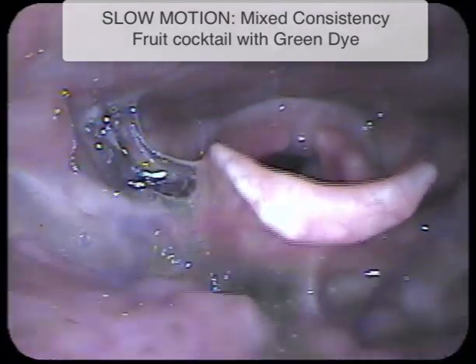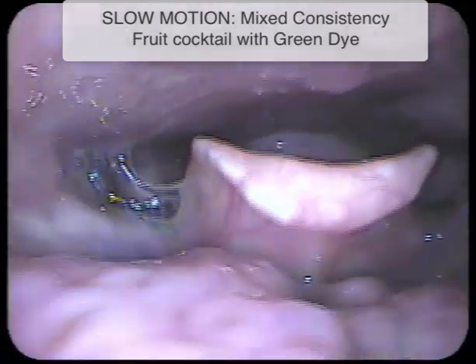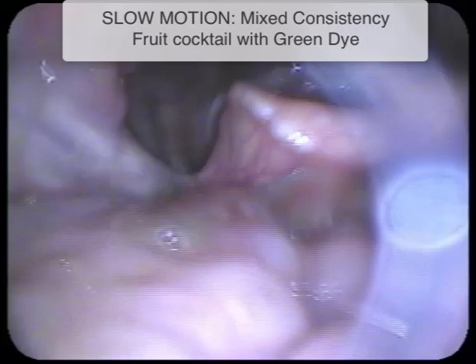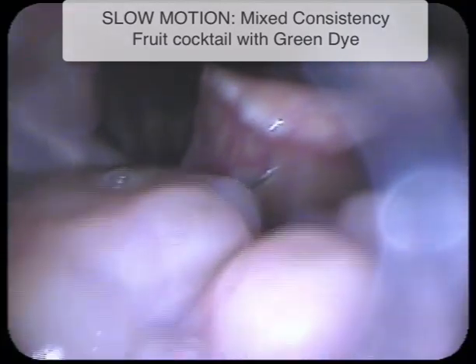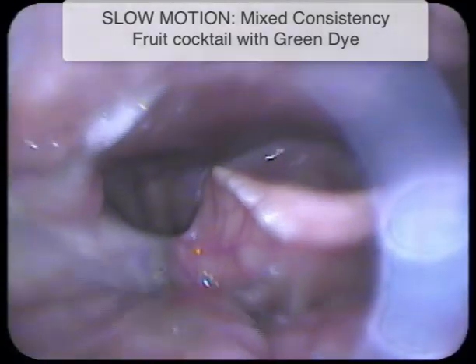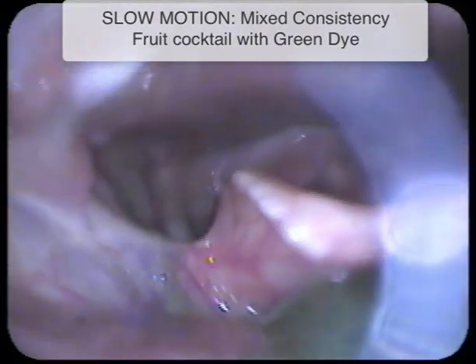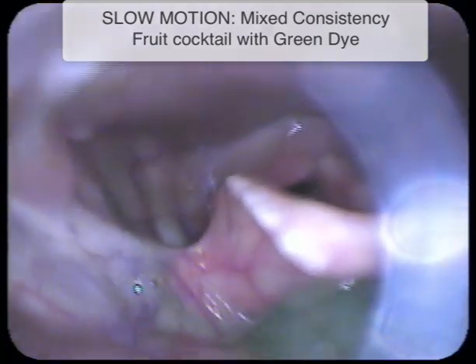In this mixed consistency, first we see the liquid swallowed. Now we see the pureed portion coming over the base of tongue and touching down into the vallecula.